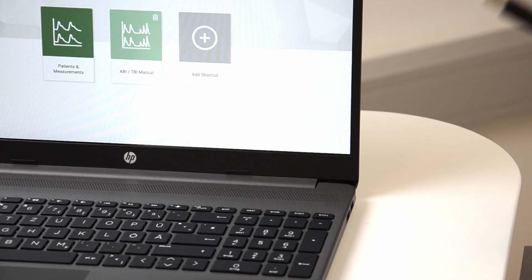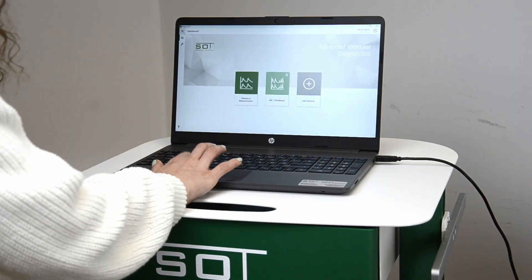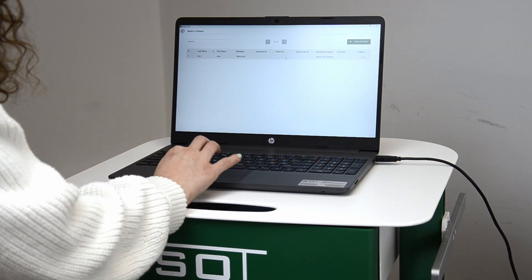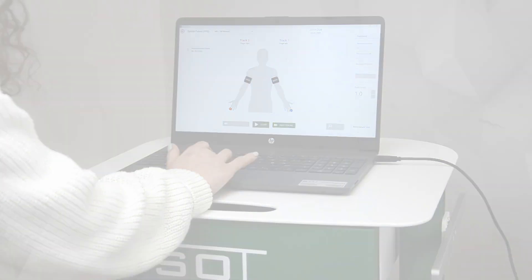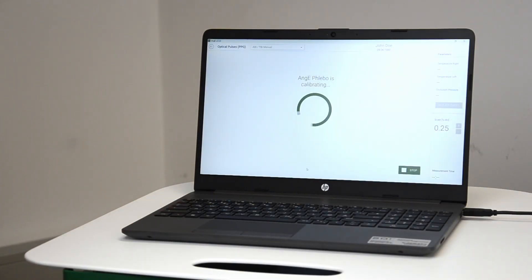Connect the USB cable to the computer. Select the patient or create a new patient in the software and select new measurement. Follow the on-screen guidance. Start the measurement and wait a few seconds for the optical sensors to calibrate.